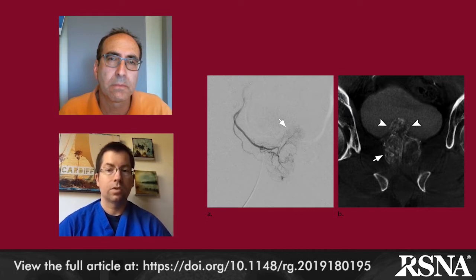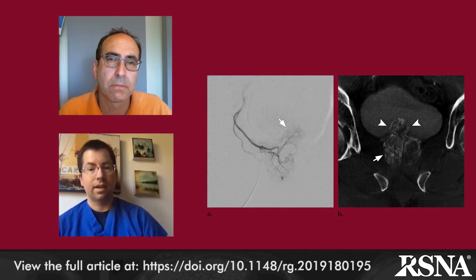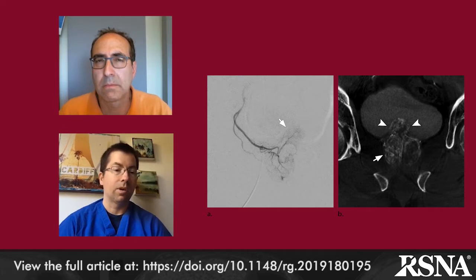This is another tool that can potentially improve the embolization process. It's a catheter with a small balloon that's inflated before embolization. The catheter and the technique are still being investigated, but it's thought that the catheter can reduce the risk of non-target embolization, allowing for more complete treatment that would improve outcomes and safety.